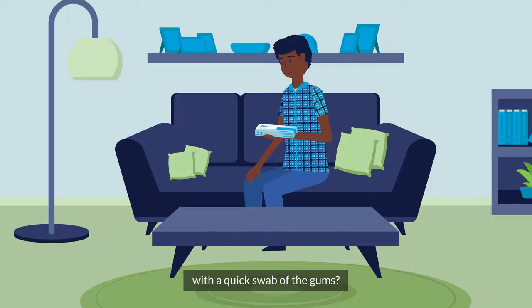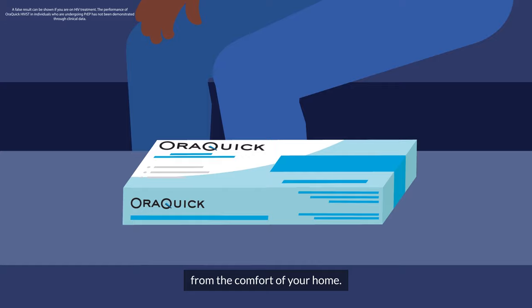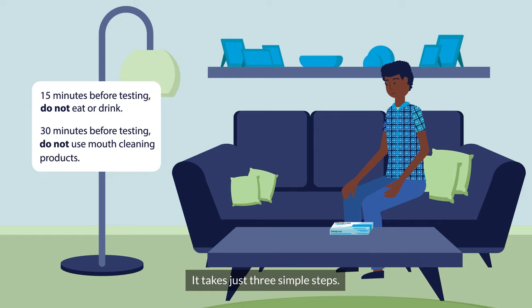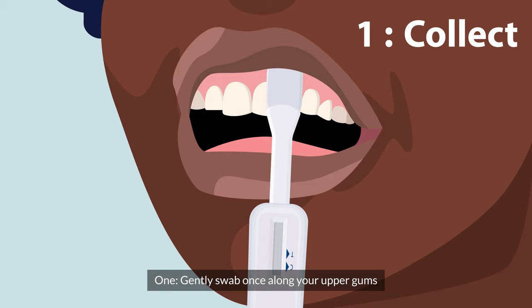Did you know that you can test for HIV with a quick swab of the gums? OraQuick provides results in just 20 minutes from the comfort of your home. OraQuick products are trusted by healthcare professionals worldwide and detect HIV antibodies with over 99% accuracy. It takes just three simple steps.